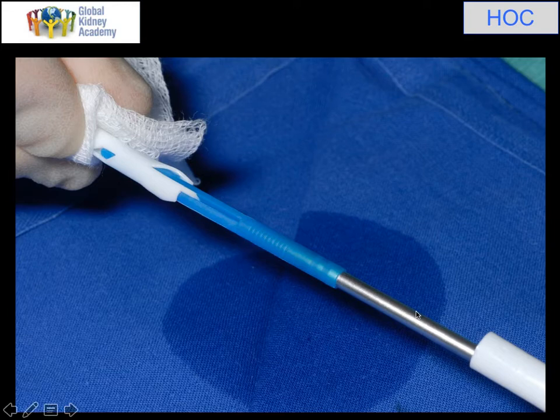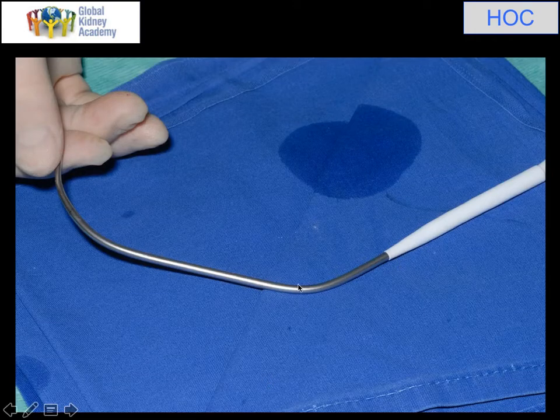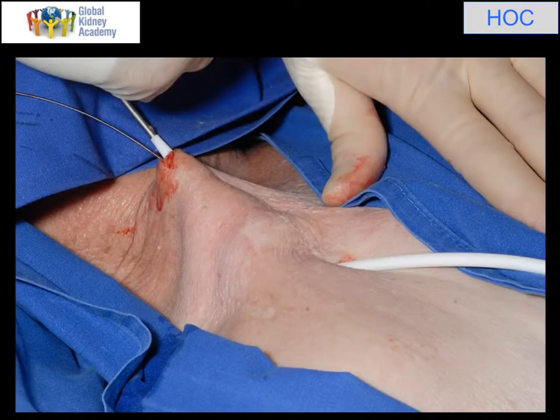The first thing I do is put a really nice big smooth quarter-circle curve on this tip of the tunneling rod. Next I push the tunneling rod back into the catheter — this has got a symmetrical tip with both lumens coming right to the end, and it's got two prongs on this particular tunneling rod. I move the cover down to cover all this up, and then I put a second bend. The second bend allows me to rotate the tunneling rod as needed. I've then pushed it vertically up and then gone round the corner and come out. I'm now bending it into one big smooth curve by taking both ends of the tunneling rod and bending it between my two hands, then slowly pulling it through. It looks painful — patients normally find this bit okay.